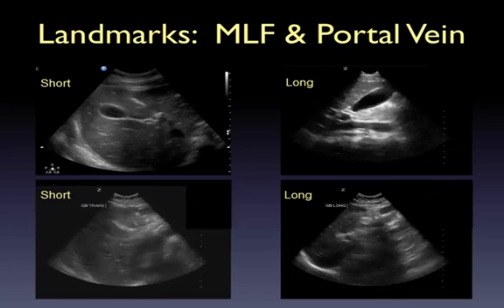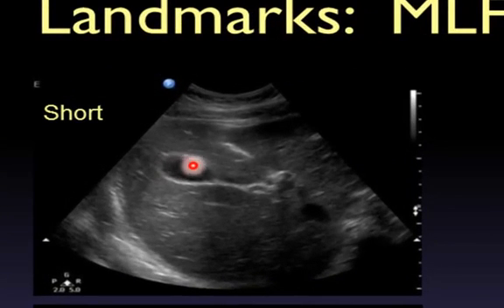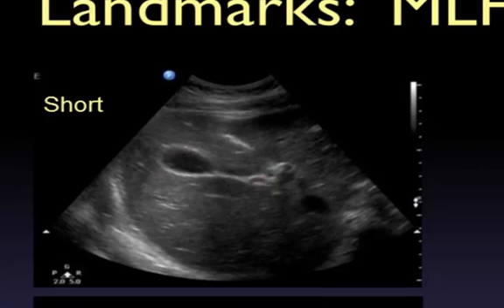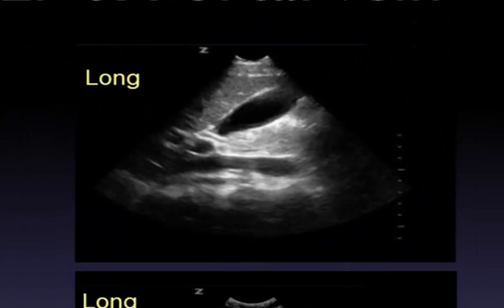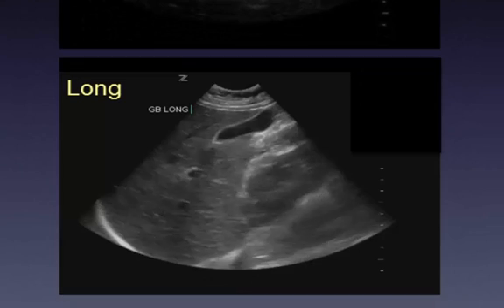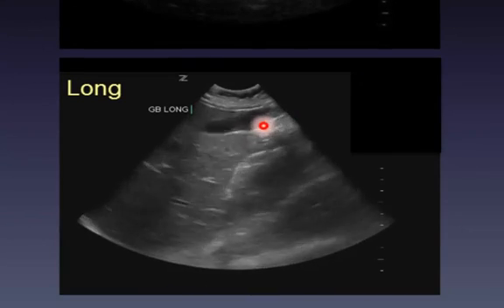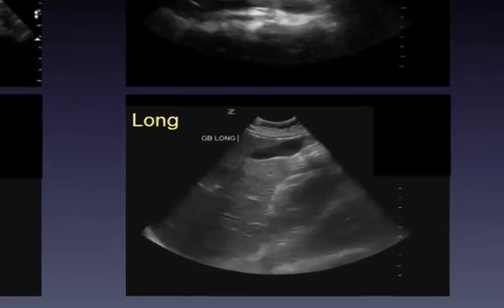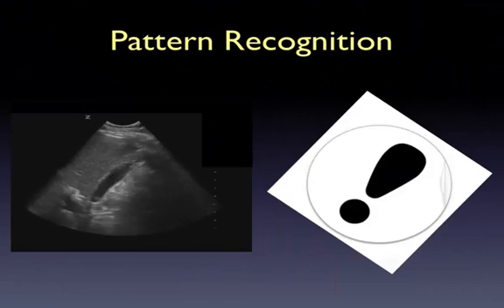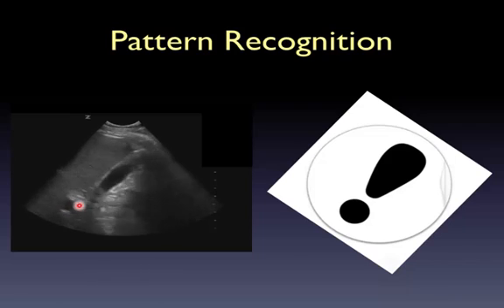Here are a few more landmark images. In a transverse or short axis view, we see the gallbladder, main lobar fissure, and the portal vein. In long axis views we see the gallbladder with the portal vein right next to the liver. Pattern recognition is important — the gallbladder has been compared to an exclamation point, with the gallbladder being the long portion and the portal vein being the point. If you can find the portal vein, you'll be able to find the common bile duct.